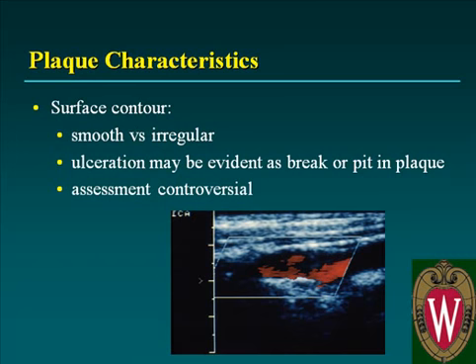Ulceration is seen as a deep pit or break in the plaque, and this can be difficult to identify. Here is an example of a plaque ulceration. Here is the plaque. Here is the flow into the heart of the plaque, indicating an ulceration.